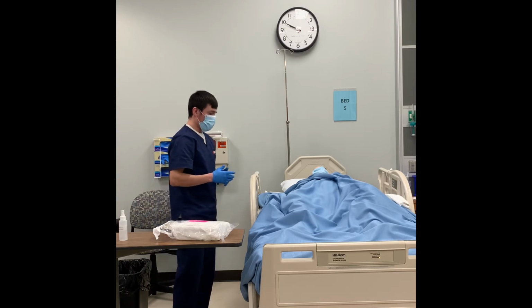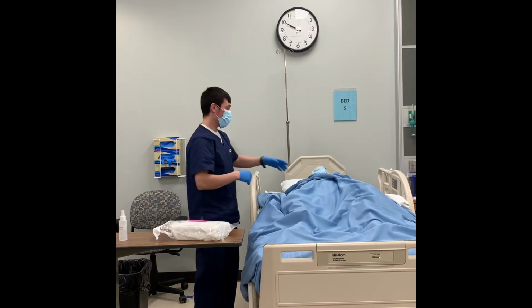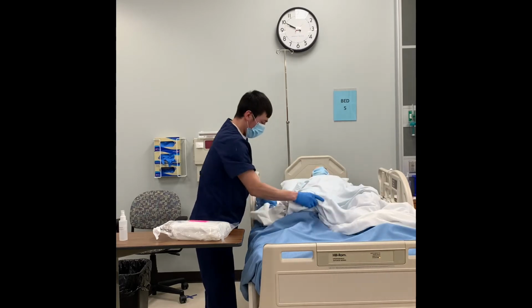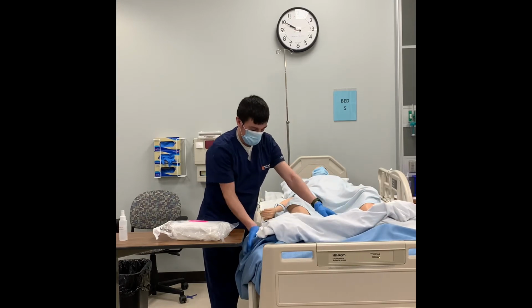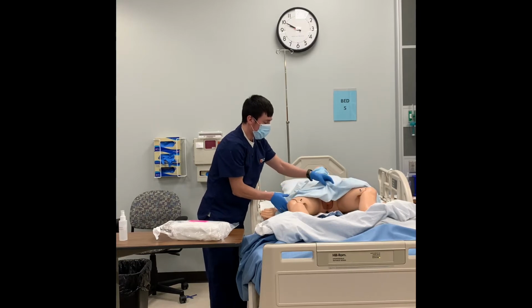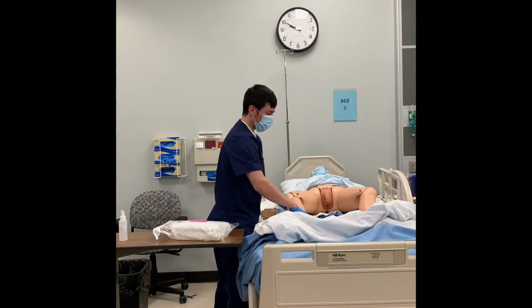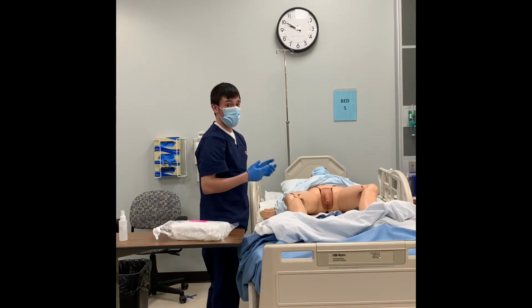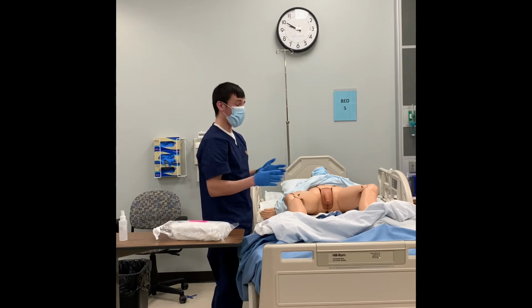Okay, so what I would do next is go ahead and give privacy to the patient. So I'm going to roll down the blanket, rolling it down far enough to make sure that I have enough room to place some stuff as I need it. And then from there, lifting up the gown, giving as much privacy as I can, and then reposition the patient as needed. So I'm going to try and have the knees bent with the legs out a little further. That way, if they can't due to the injury, we can keep their legs straight and just try to have their legs out wider again.